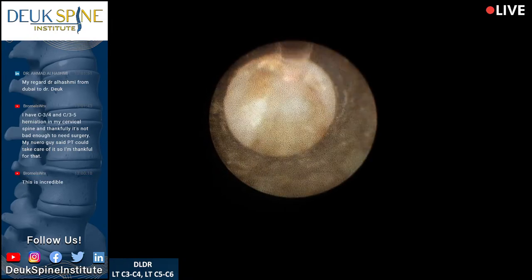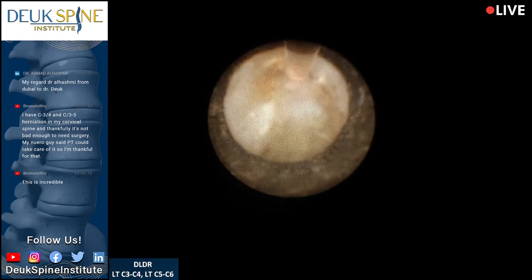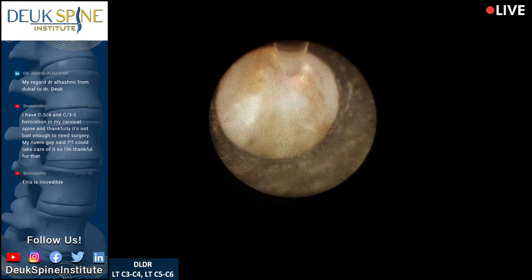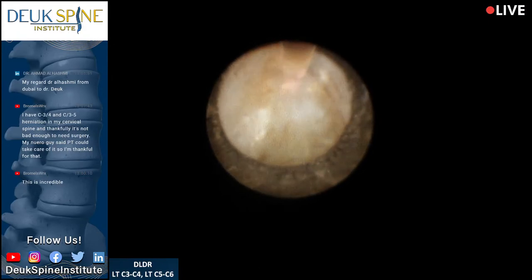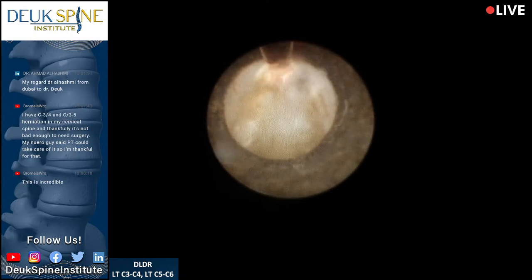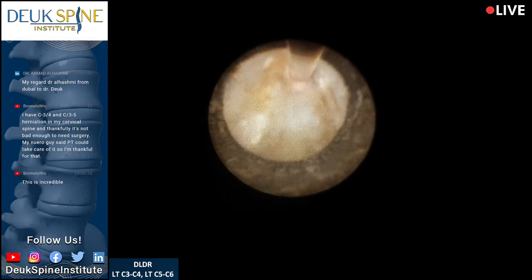It has everything to do with the debridement of the annulus, which is the hallmark of my surgery — the Deuk Laser Disc Repair. We try to get that information out to people so they understand it's a fixable problem; they just need the right surgery.